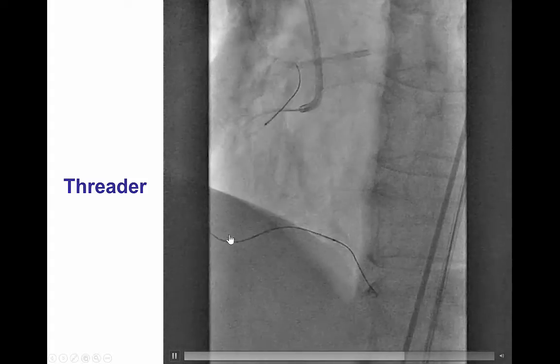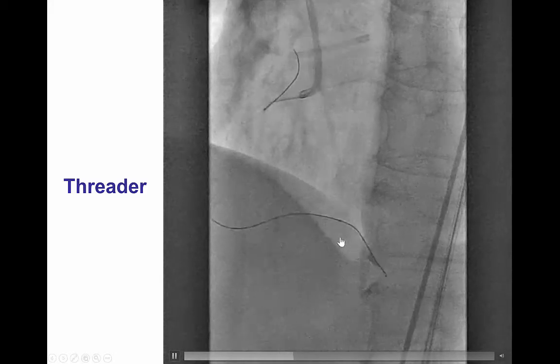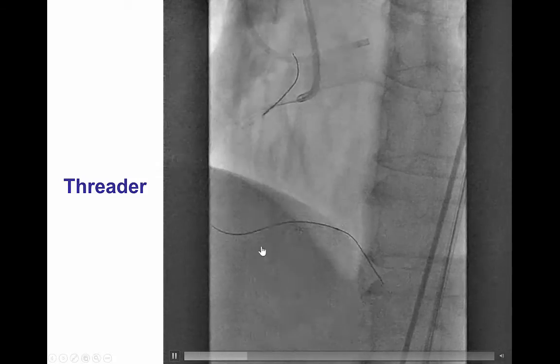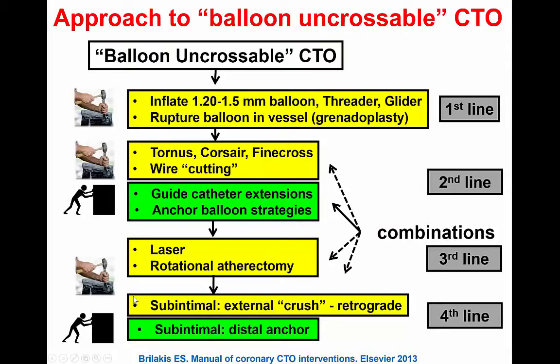We had a lot of difficulty advancing equipment past that area, requiring multiple maneuvers. Finally, a Threader microcatheter was able to be advanced around and dilate that area. This is an example of a balloon uncrossable CTO — we have sub-intimal crossing but cannot advance equipment through it. There is a systematic approach starting with small balloons and the Threader microcatheter, escalating to more aggressive maneuvers including various microcatheters, support strategies, side branch anchor balloon, laser, and sub-intimal techniques.